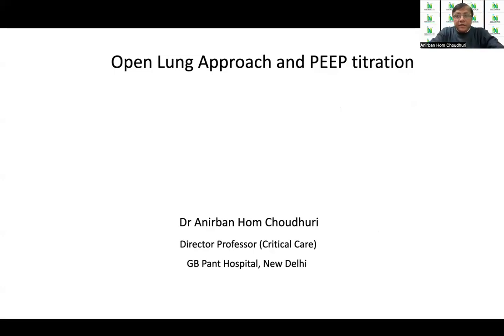Dear friends, in this video, we are going to discuss the various means and approaches for open lung approach and PEEP titration. We all know that open lung approach is a very important strategy in treating patients with ARDS on mechanical ventilation. It is also implied that in these patients a considerable amount of PEEP has to be applied. And there are some means to know what the optimal PEEP is. Only when that optimal PEEP is applied for a definite duration can the benefits be expected.